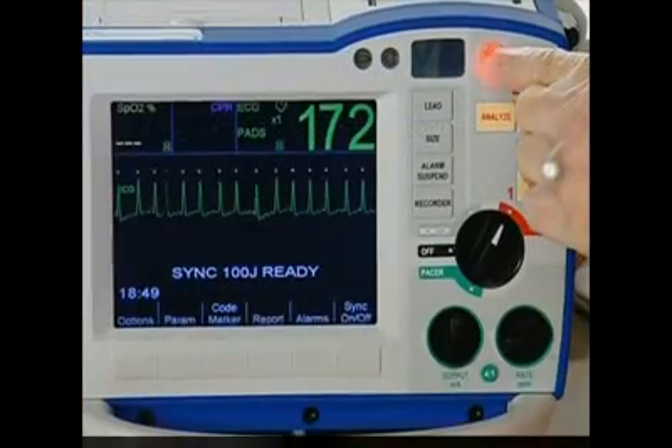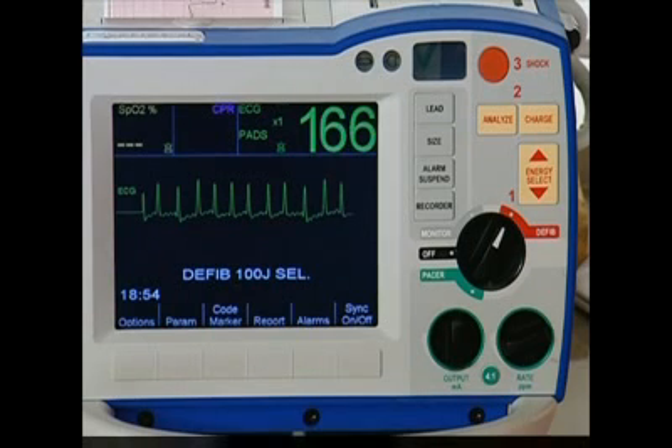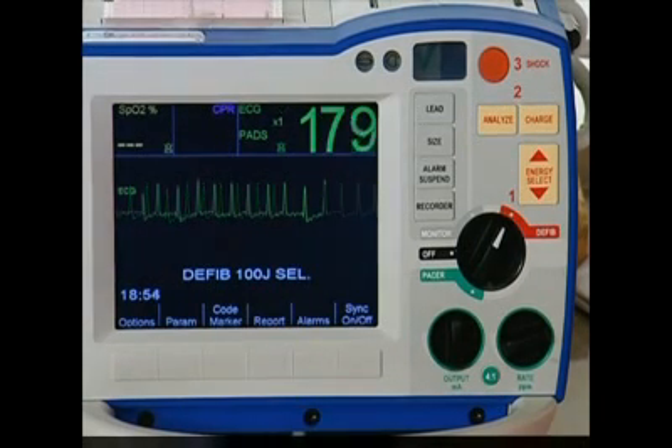Press and hold the illuminated shock button until the discharge occurs. The defibrillator will automatically go out of sync mode after you deliver a shock, unless your institution has configured it otherwise.